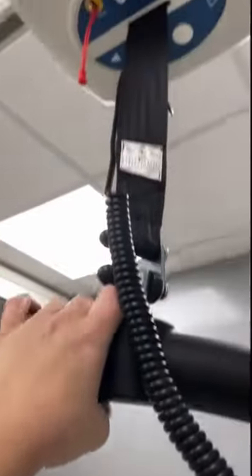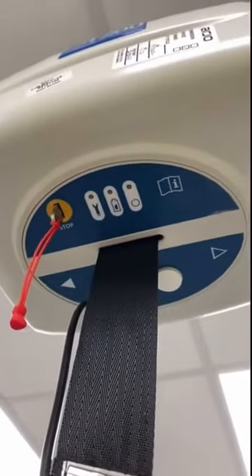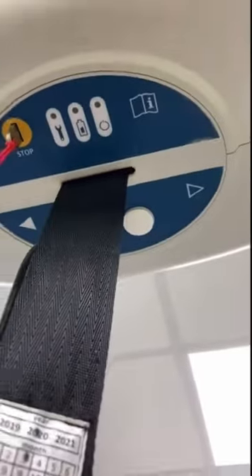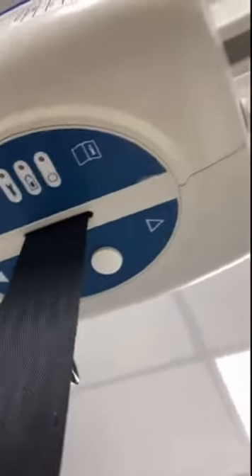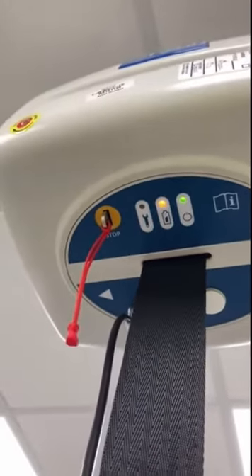If you find that the hoist isn't working, the first thing to do is to check this. If it has been pulled slightly, there will be no power button lit. So if there is a report of a fault, the first thing to do is just make sure that it has been pushed in — it should then work again.